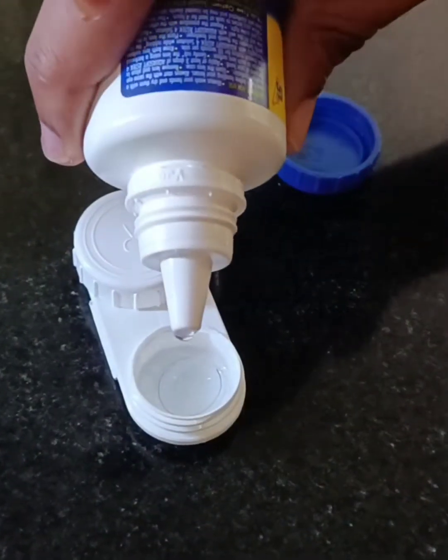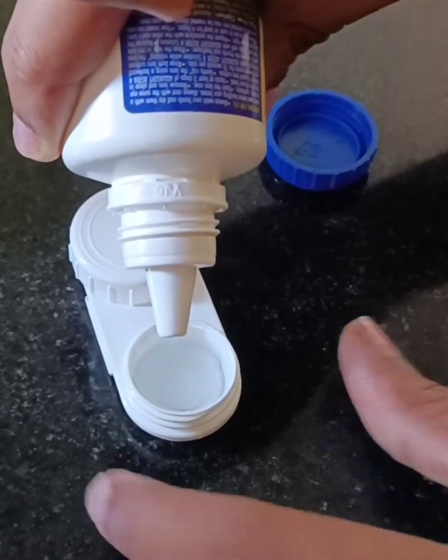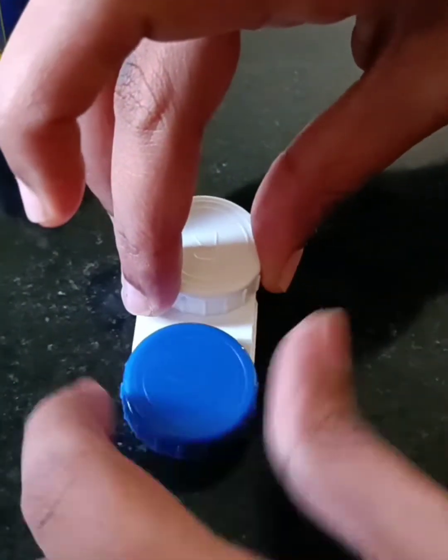After that, close the contact lens case and keep it for a night. Proper time is required for the soaking process to remove all the dirt and debris. If the dirt and debris still exist, you have to repeat these steps.